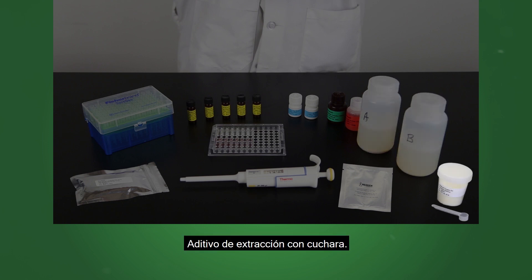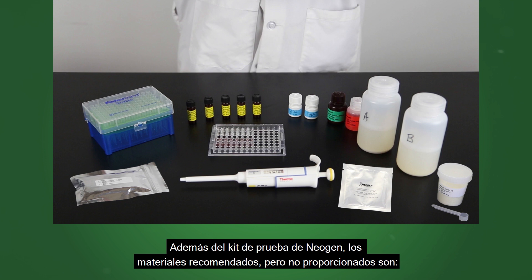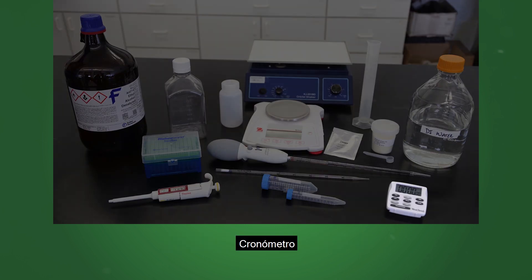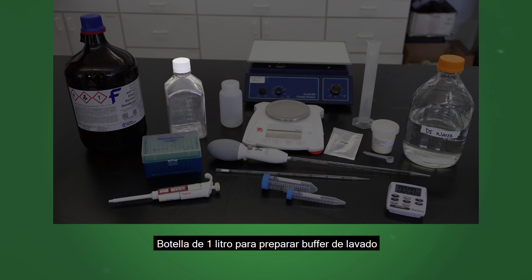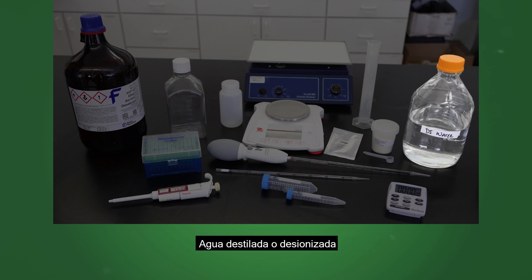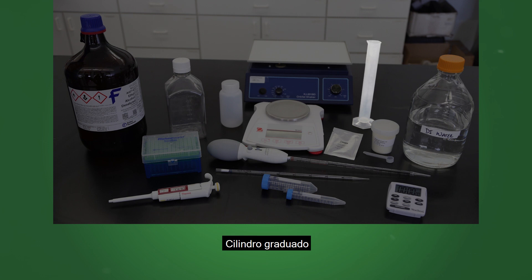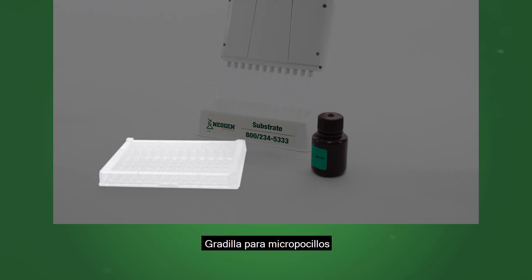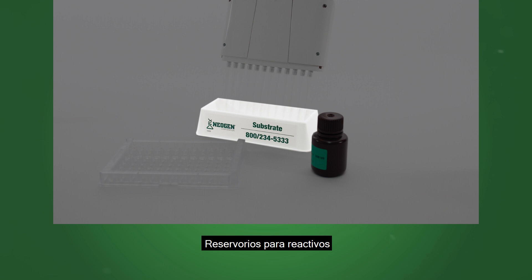The kit also includes extraction additive with scoop. In addition to Neogen's test kit, materials recommended but not provided are a microwell strip or plate reader, timer, 1 liter bottle to prepare wash buffer, deionized or distilled water, graduated cylinder, wash bottle, pipette tips, adjustable single and 12 channel pipetter, microwell holder, and reagent boats.